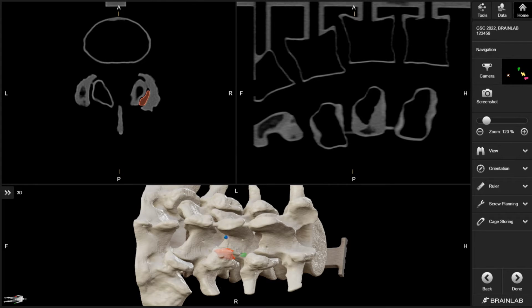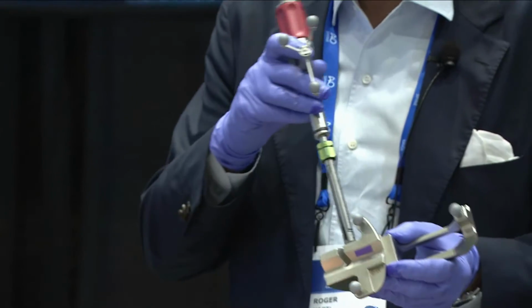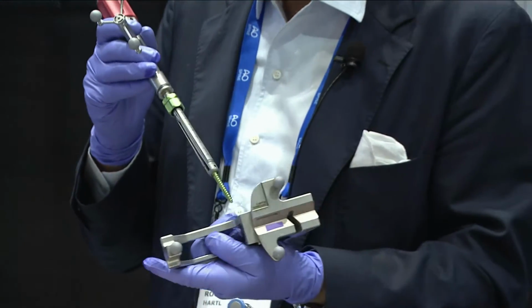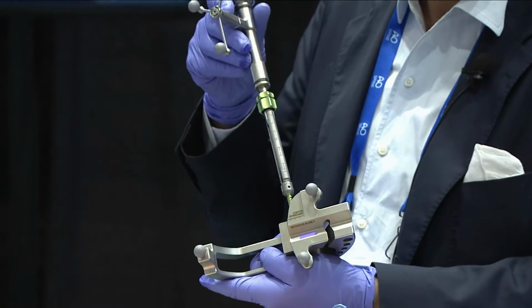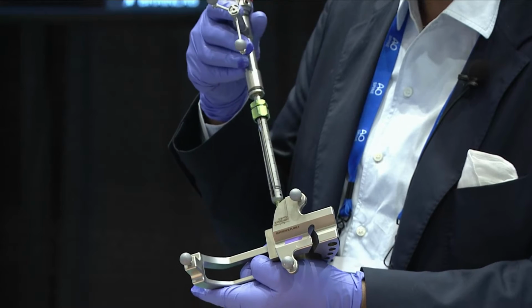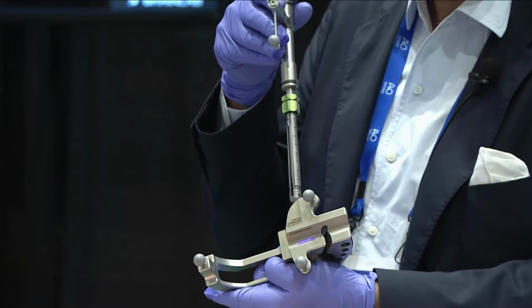Yeah, maybe it's not calibrated. Huh? So let's calibrate it. Maybe we didn't do it. So this is the instrument that we use for calibration, and the process is pretty streamlined. And then the divot. If you have any questions, comments, just go ahead. We can make this very, very conversational.